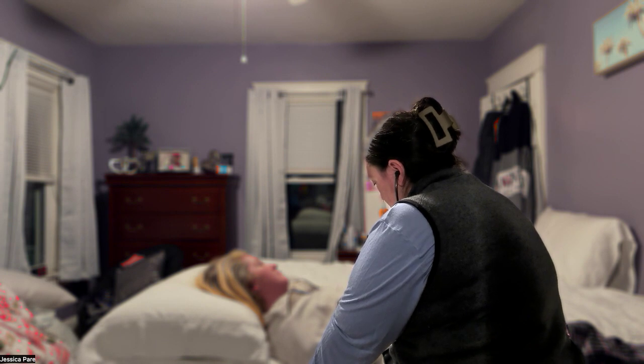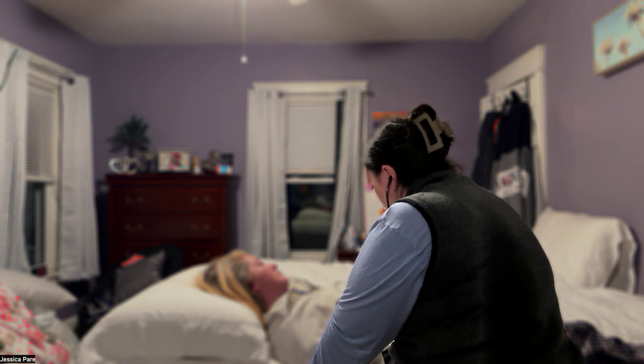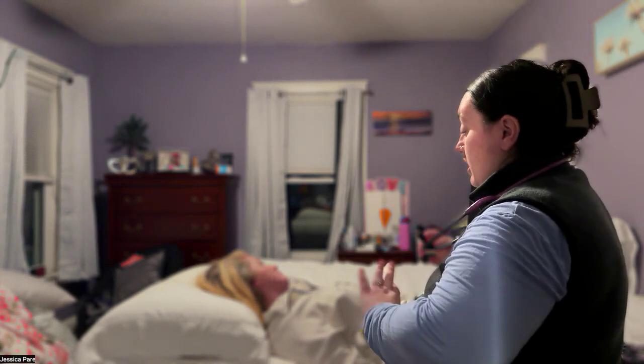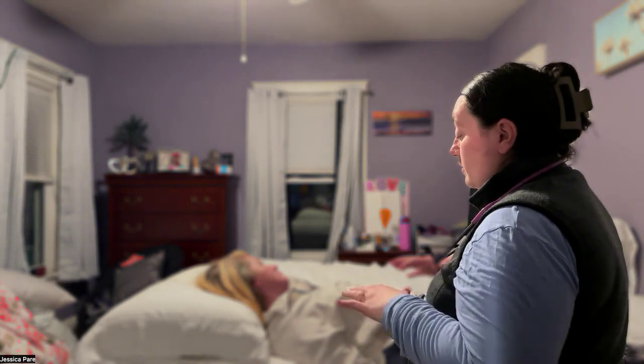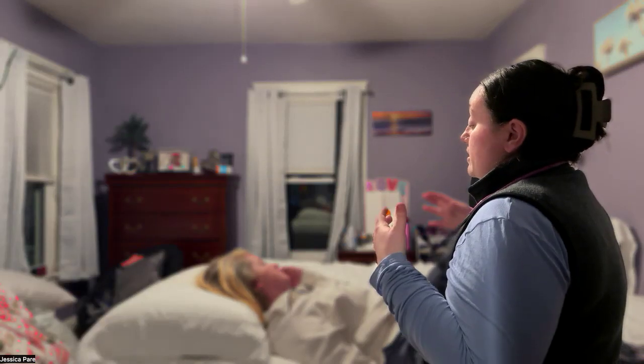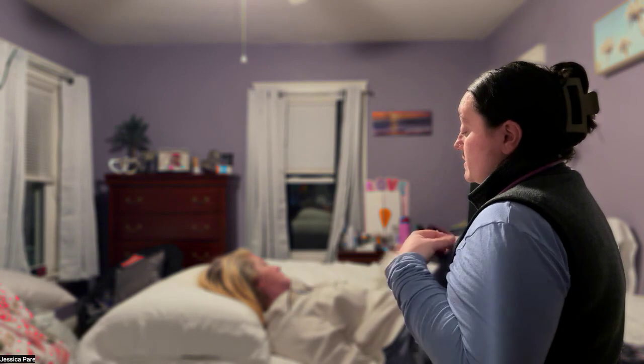And we're hitting all those same points down at the tricuspid and the mitral. Perfect. Heart sounds are normal and regular. They are not tachycardic. I did not hear any murmurs, rubs, or gallops.